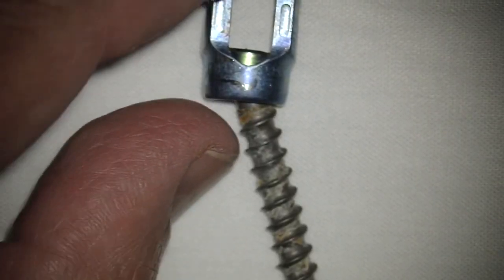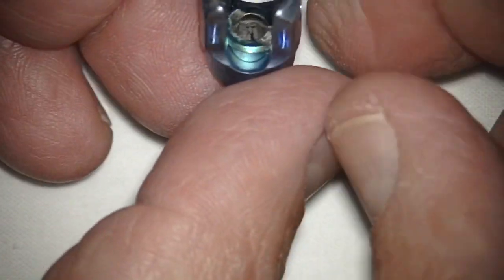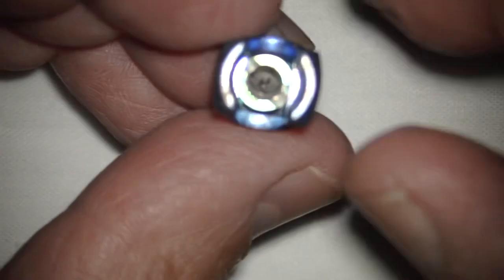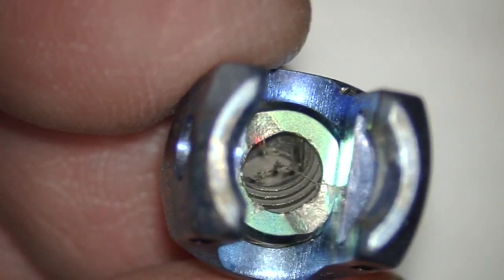In this video, I will show you a surgical trick on how to remove deep-seated screws at L5S1, specifically second-generation screws. I think this is a Depuy Expedium screw. There's an outer portion and an inner shaft portion, and you have to basically get them lined up to get it out.